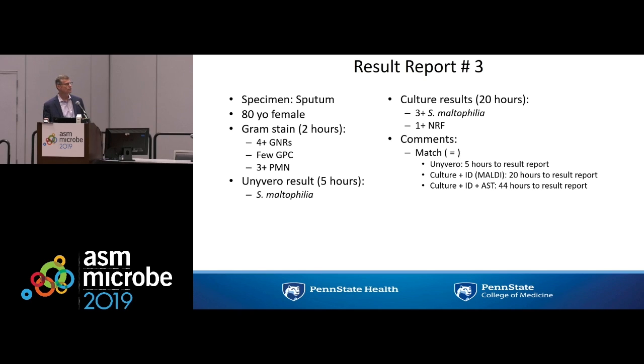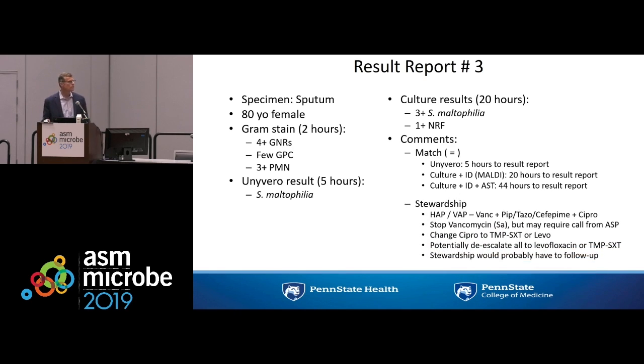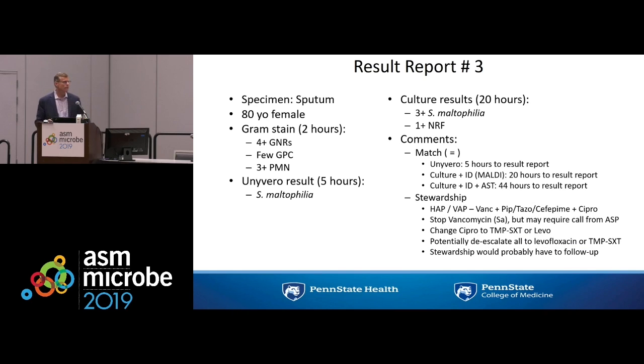And then for susceptibility testing, for the math, I decided to add 24 hours. Most of you would know that Stenotrophomonas would probably be covered by trimethoprim sulfa, although there are potential options, and so the susceptibility test does become relevant here. It's rare for us to see organisms at our institution that are resistant to trimethoprim sulfa, but nevertheless, we would want to have that report before we concluded.